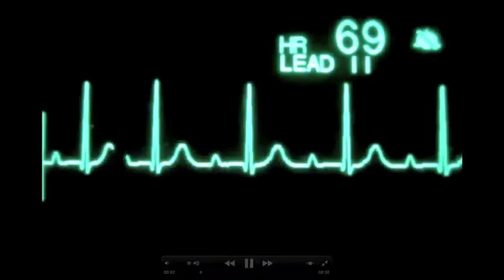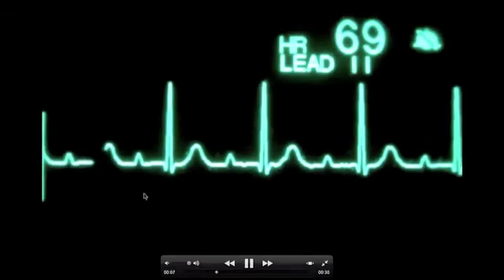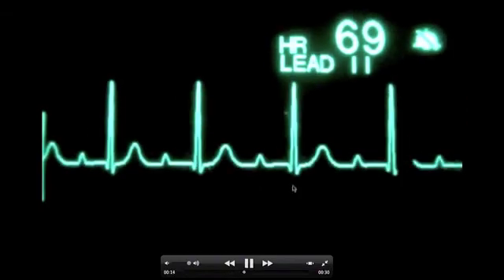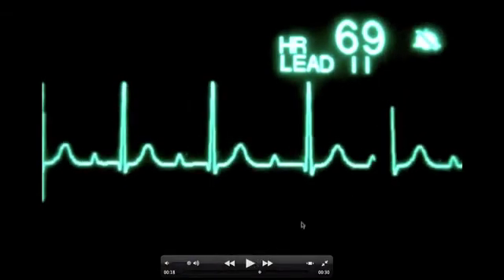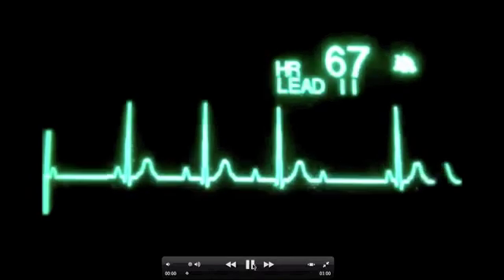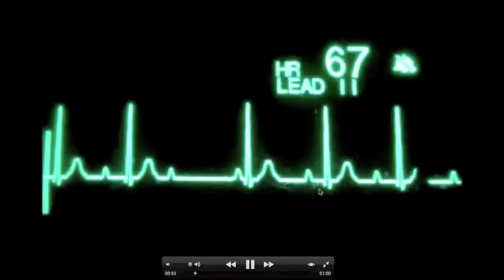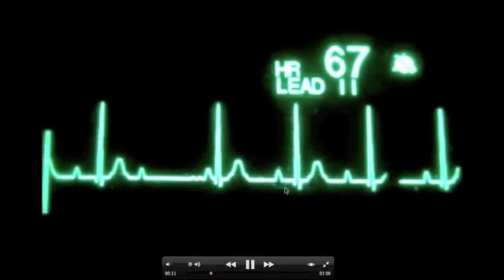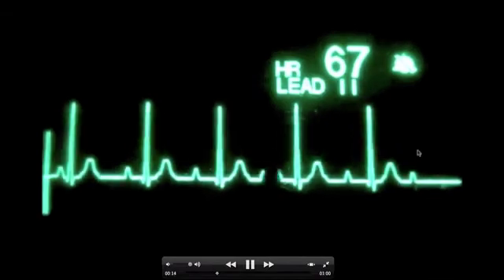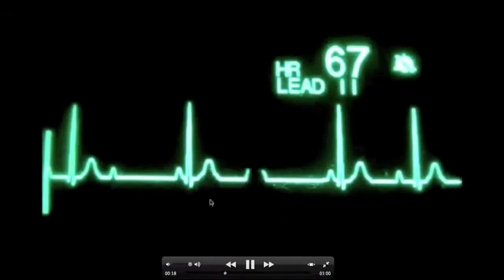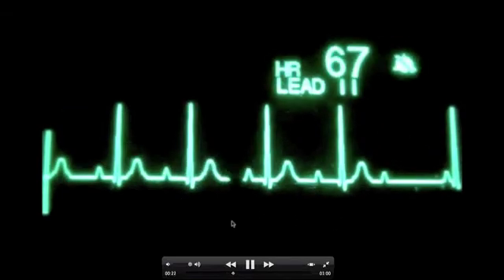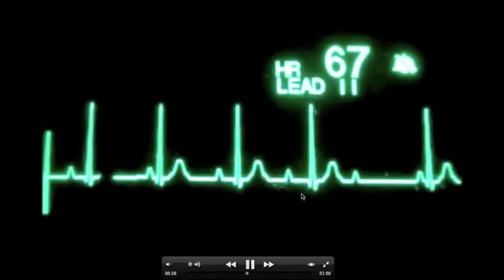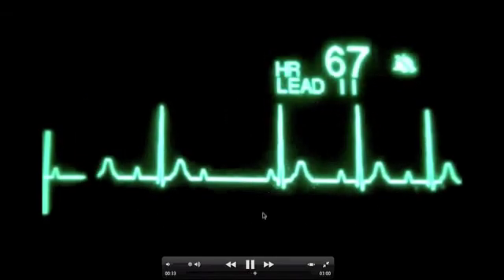Let's look at a video of our first degree heart block. You can see a nice R-to-R interval, normal P-to-P intervals, and just a long PR interval — that is sinus rhythm with first degree AV block. Now let's look at second degree type one: long, longer, longer, drop, normal — longer, longer, drop, normal — longer, longer, longer, longer. This is a classic second degree type one Wenckebach-type heart block with progressively prolonging PR intervals.